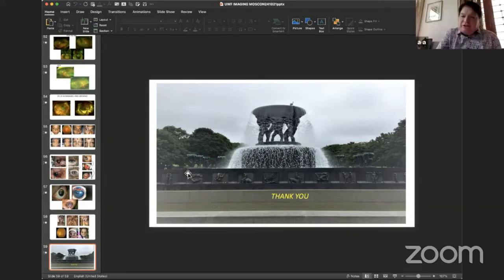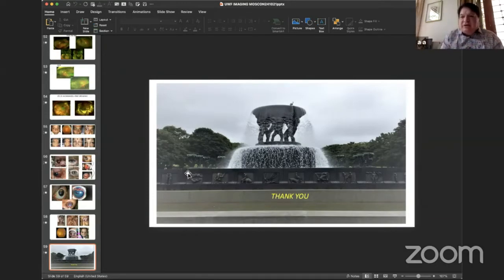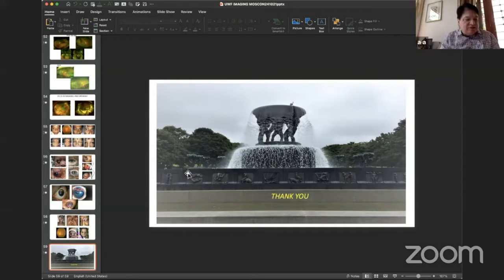One question before we close your talk. Can we somewhere crop this lid shadow? Yes, it can be. That's probably the only issue I had, that whenever there is a lid shadow, it distorts the whole thing. So if you can crop it, that's probably the best thing. Whenever you want such pictures, there are two things. You have to use the lid speculum, which has plates, or otherwise you can use the stickers which come with every surgery drape. Don't throw away the stickers. Use them in the OPD. Attach them to the lids. Wonderful, good idea. I think we should shift to the next talk.